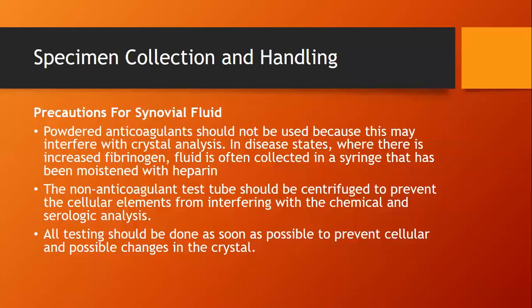So in collecting the specimen, we should take note that we do not use powdered anticoagulants. Why? Because powdered anticoagulants may cause artifact formation that may interfere with crystal analysis.